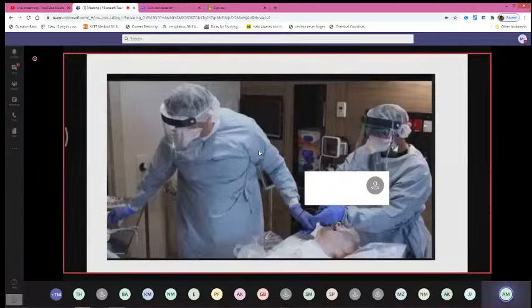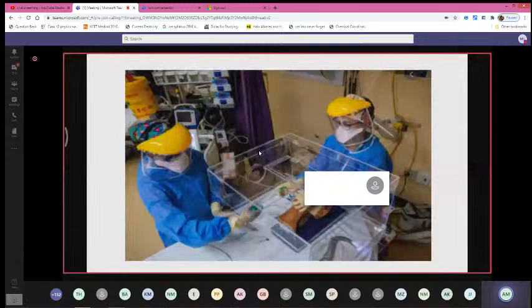So this is an intubation box which came with a lot of promises initially. Even in our hospital, we had 3 of these boxes ordered during the initial phases, and we tried to use them. But the problem is that when the patient is acutely hypoxemic, we have very little time to intubate and secure the airway. These devices come with their own disadvantages.